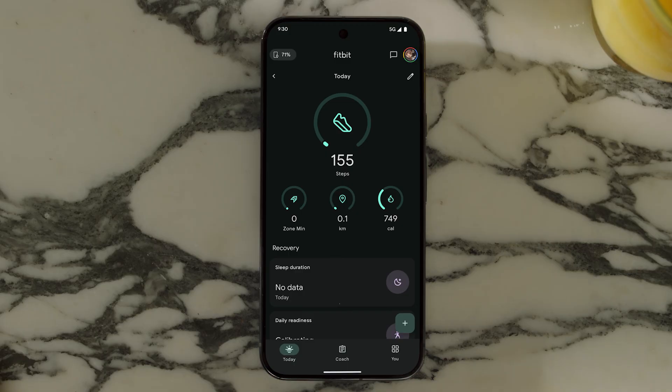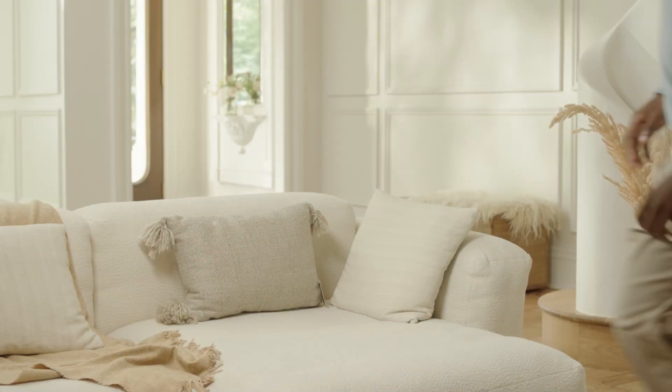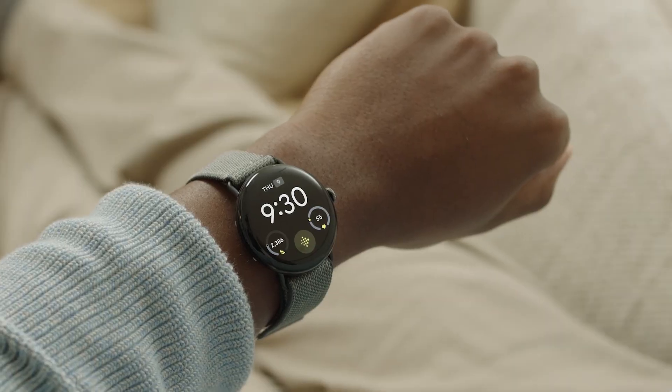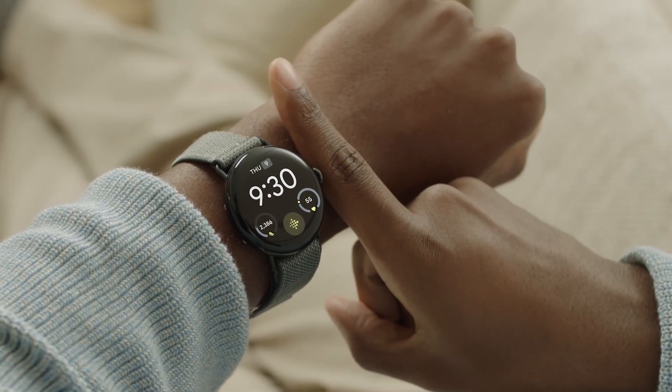Make sure the Fitbit app is set up on your phone and your watch is connected to your account. Find a comfortable, quiet place to sit and relax. Make sure your watch is one finger width below your wrist.